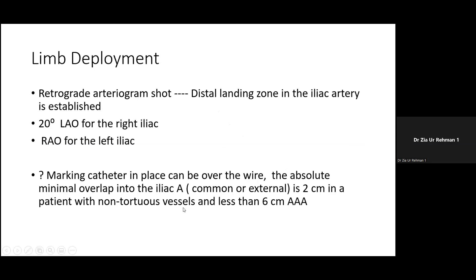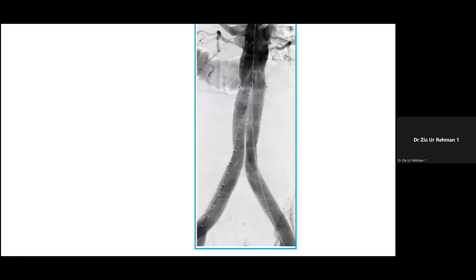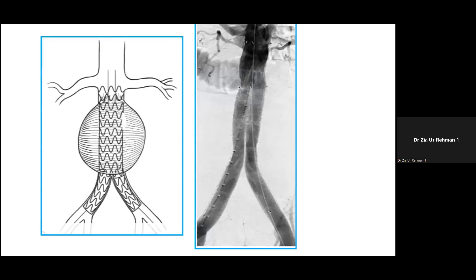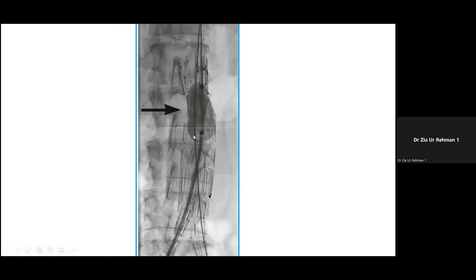The marking catheter is placed over the wire, allowing a 2 cm landing zone in non-tortuous vessels with aneurysms less than 6 cm. The iliac limb is then placed, and the same is done on the other side. Before finishing, a CODA balloon — a compliant balloon — is placed within the graft to remove kinks and appose the wall. Never place the CODA balloon at the junction site, as it can cause rupture. The suprarenal barbs, present in most stent grafts, are placed above the renal vessels to provide anchorage.